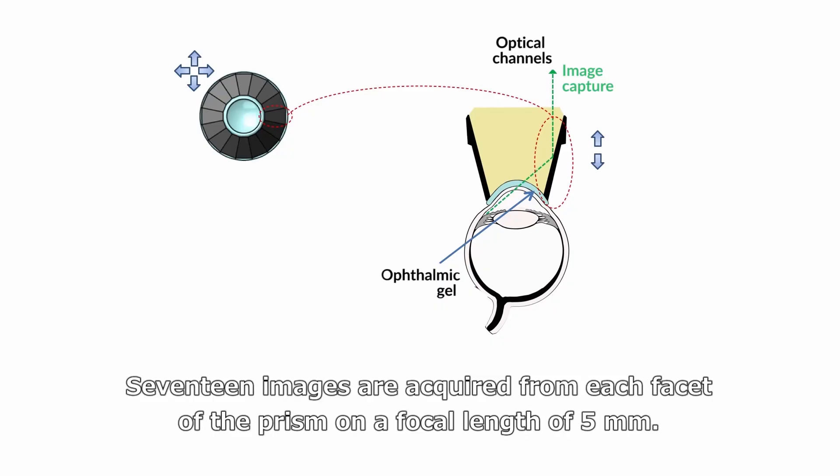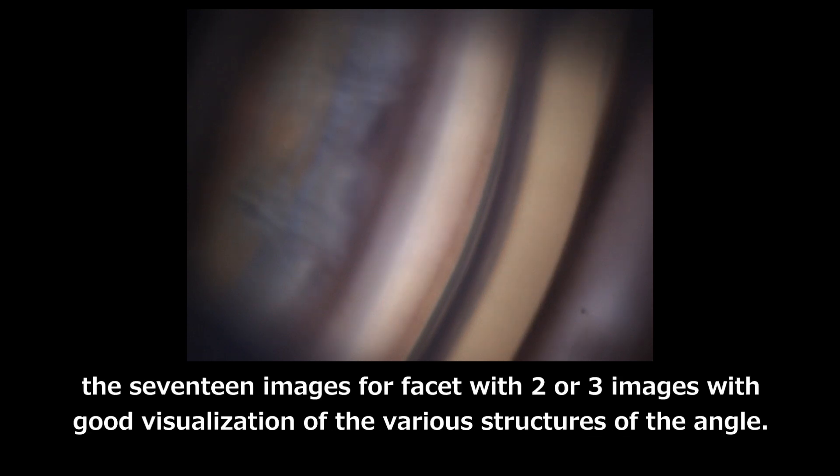17 images are required from each facet of the prism on a focal length of 5 mm. And here we can see in slow motion the 17 images for a facet with two or three images with good visualization of the various structures of the angle.